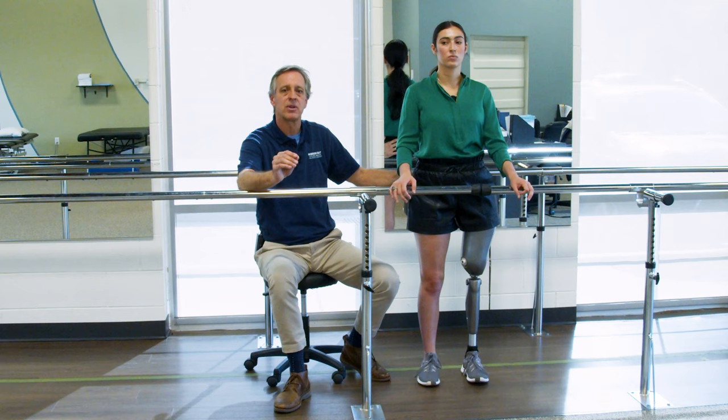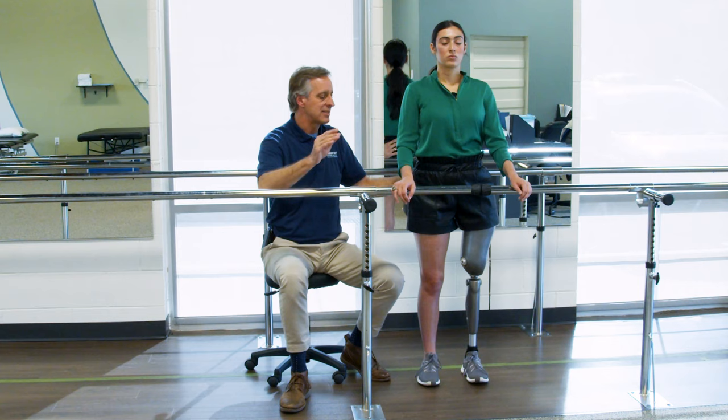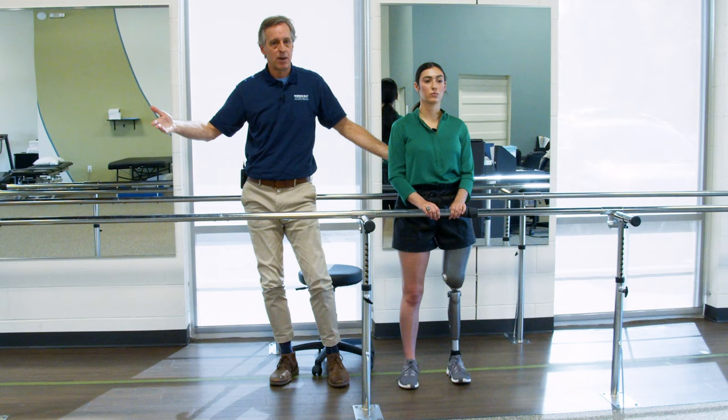Three reasons why crossover braiding drill is so important to you. It is the number one best stumble recovery drill. For example, if I'm in a position, I've lost my balance to the right, my weight's on my right foot.